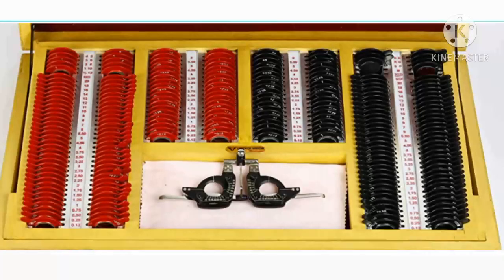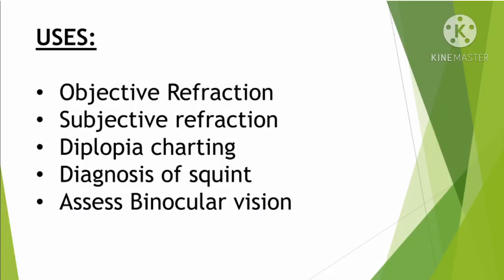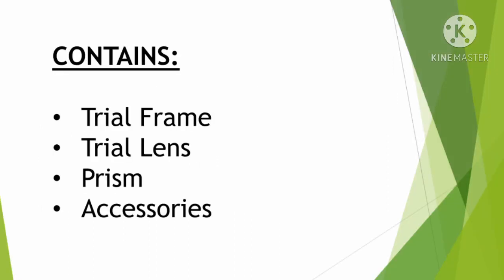This is how a trial box looks. We use the trial box for objective refraction, subjective refraction, diplopia charting, squint diagnosis, vision testing, and to assess binocular vision.